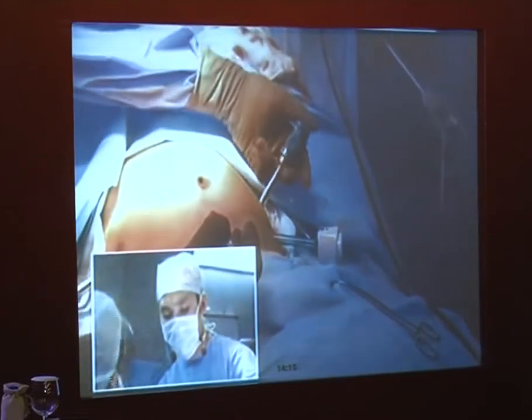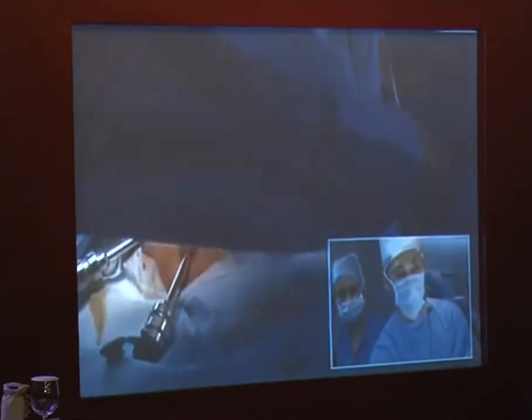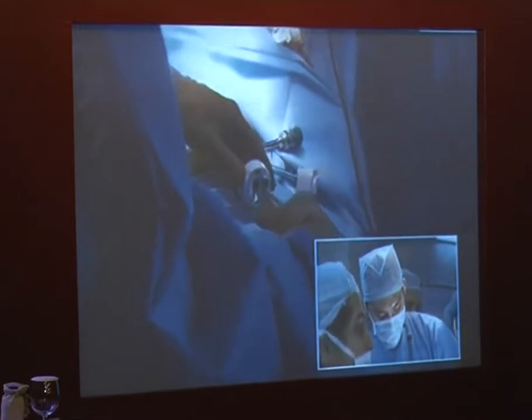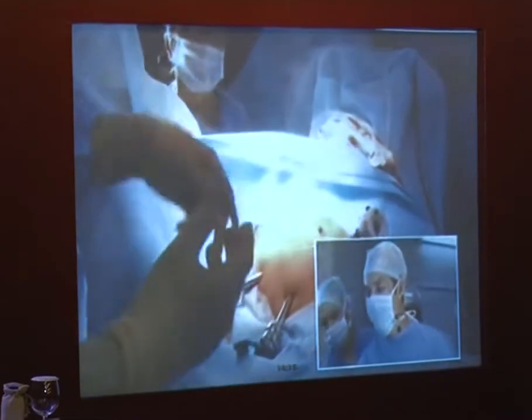This is a time saver, because when it comes time to sew, all my team has to do is an instrument-guided exchange, and I'm ready to go. I don't have to worry. We pull the needles out, the two at the end of the case. So we're ready to dock at this point, and we'll go ahead and get started.